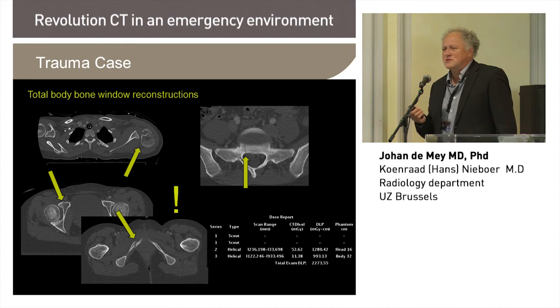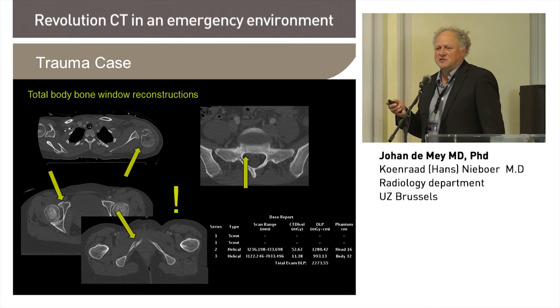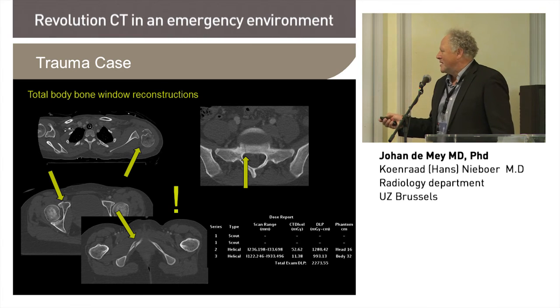My advice, certainly to the younger radiologists in my department, is take your time to view all the images. That 1 or 2 minutes, they won't matter. Don't try to give an answer in 5 seconds. It will be a wrong answer.